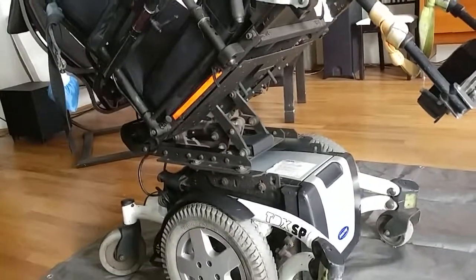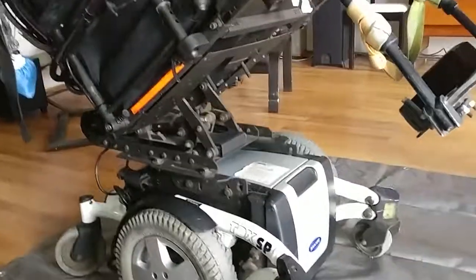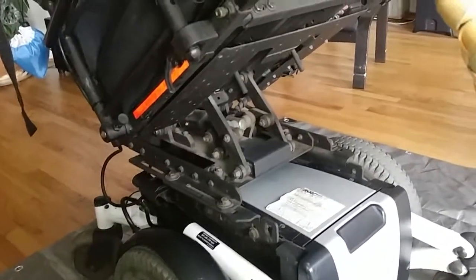Got to clean this mechanism here in the middle, the seating system, tilt mechanism. Got to get that cleaned up and re-grease the rails, which are on the left and right side there.